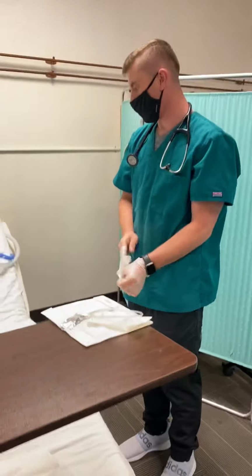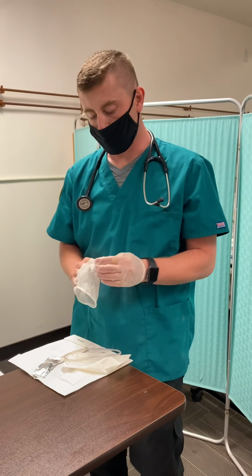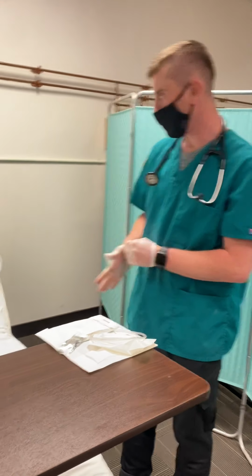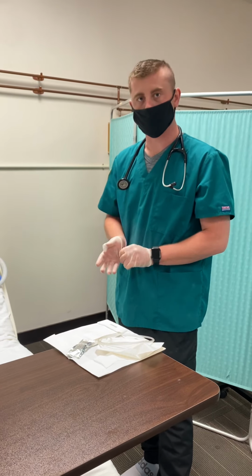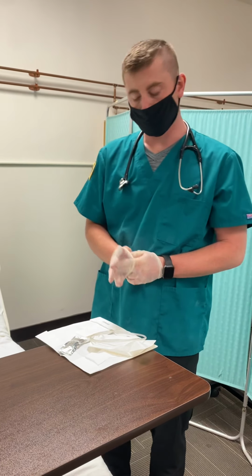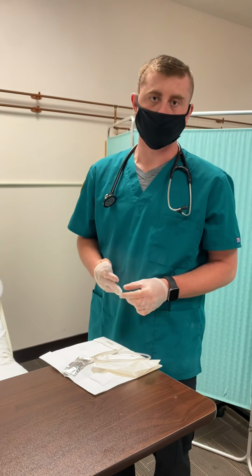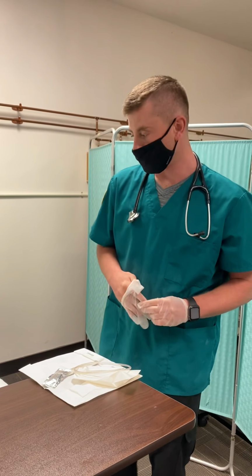I would monitor the patient to make sure the patient is not having any adverse effects from the suctioning. Make sure everything is still where it should be, ventilator settings and such. I would reassess the patient's vital signs as well as general appearance and breath sounds.